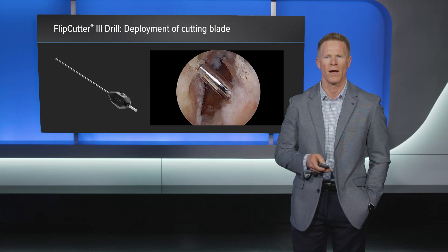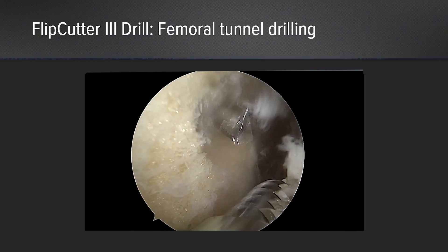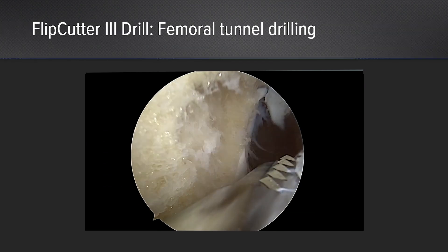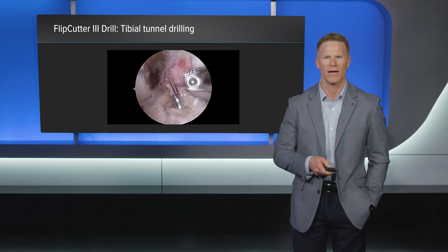This is also performed on the tibial side. Once the flip cutter has been activated, our femoral tunnel is created and a shaver is inserted to remove any loose debris prior to passing our fiber stick. The tibial tunnel is created in a similar fashion. The advantage of the flip cutter 3 is if my graft size on the tibial end does not match the graft size of my femoral end, I do not need to open up a second flip cutter device. I'm able to simply dial down or dial up to improve my accuracy during tibial tunnel creation.